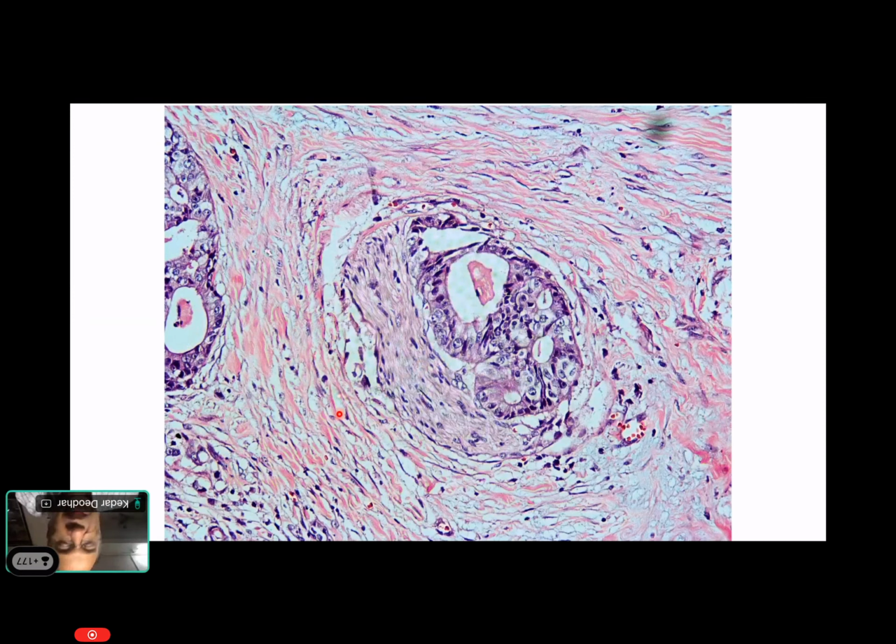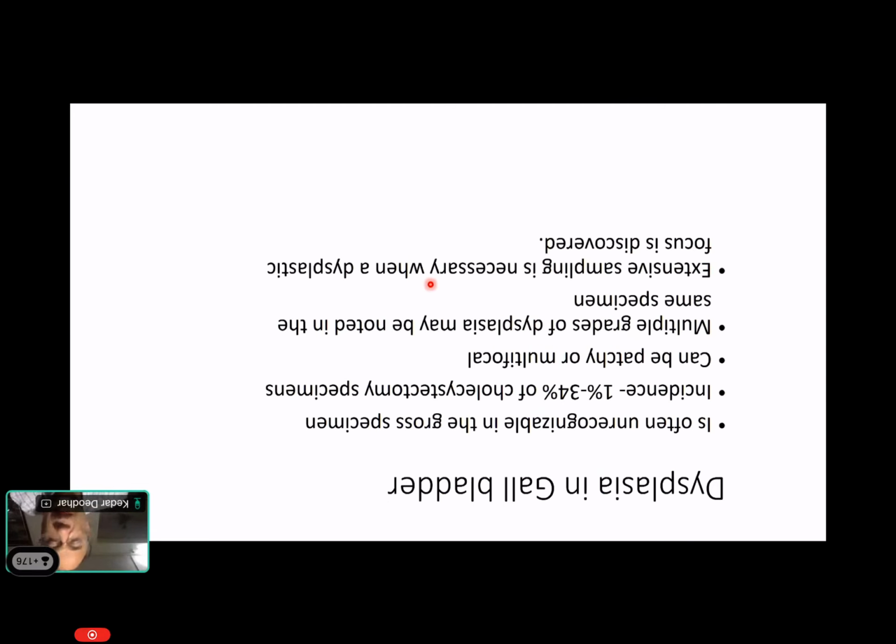Yeah, okay. So this is an example of perineural invasion. Involvement of Rokitansky-Aschoff sinuses actually is a very difficult area. What is dysplasia? What is high-grade dysplasia going into the sinus, and what is actually carcinoma? Indeed, it is a difficult area even for experienced histopathologists. And what we look for is actually a fibrous area along with the dysplasia in the sinuses. I think I'll show you a couple of examples.